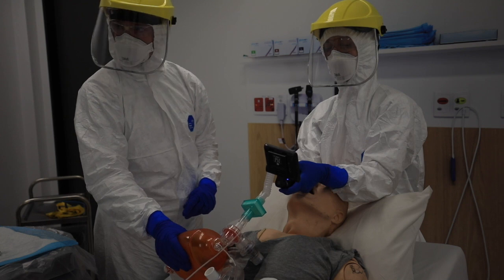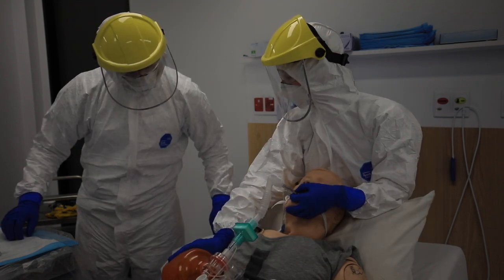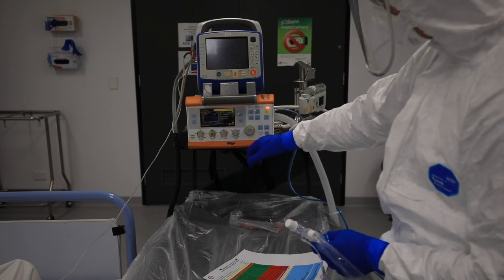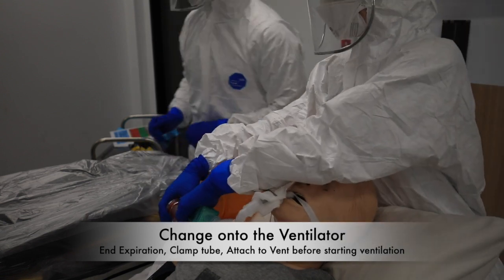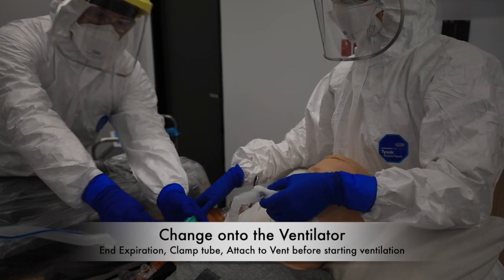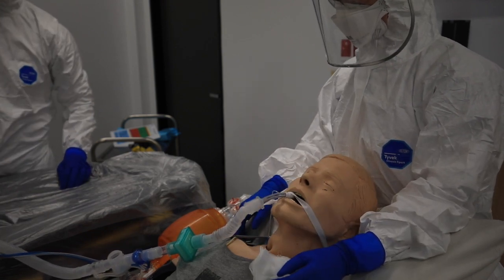Bougie away — no herniation. End-tidal confirmed. No cuff leak — we're happy. Alright, excellent. Changing to retrieval ventilator now. 100% O2 please. Inhale, exhale — clamping. Clamp applied. Push and twist connections — push and twist confirmed. Clamp off. Confirm chest rise and end-tidal — chest rise present, good end-tidal confirmed.